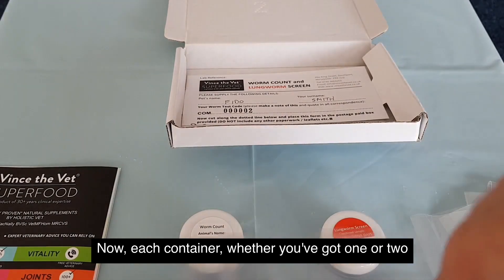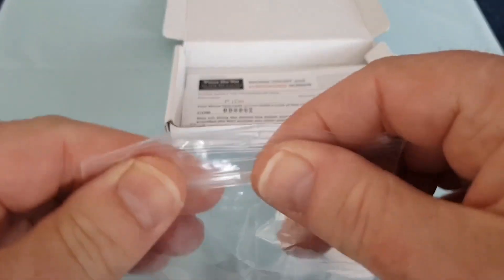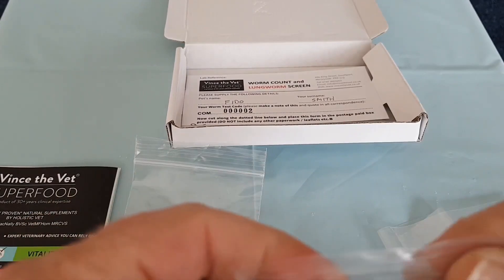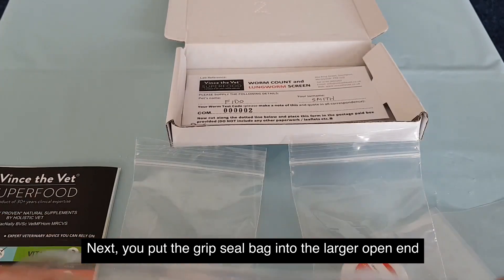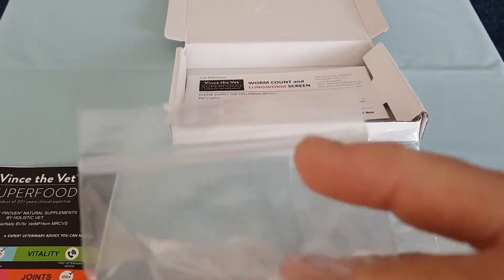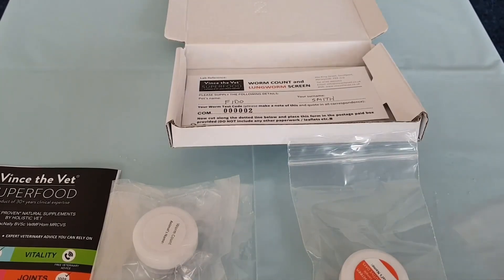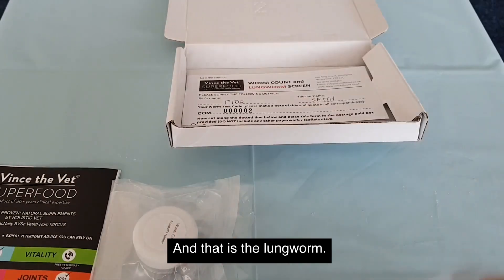Each container, whether you've got one or two, goes in its own individual grip seal bag — there's the worm count, and there's the lungworm. Next, put the grip seal bag into the larger open-ended bag. That's the worm count, and that is the lungworm.